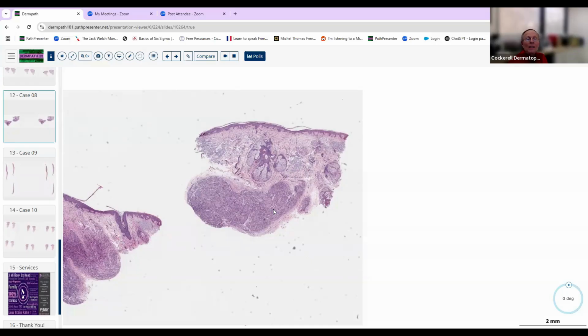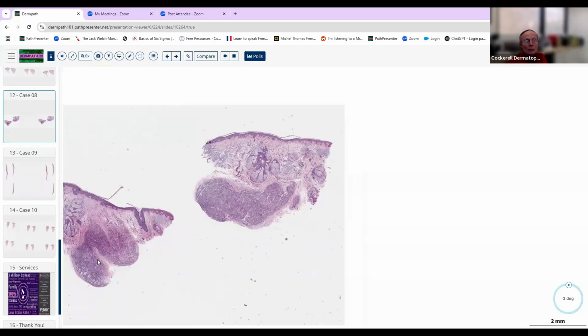And so clinically, they felt a small papular lesion, and it probably felt a little bit deep to them. So they probably weren't totally sure what it was. Probably felt like, again, maybe a subcutaneous or dermal nodule here. So they said, well, let's not do a shave, let's do a punch. And it's a good thing that they did, because if they'd have taken a shave biopsy up in this area here, they wouldn't have gotten it, because this is situated down here.